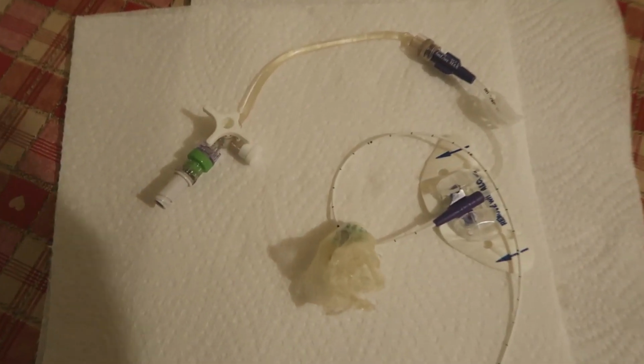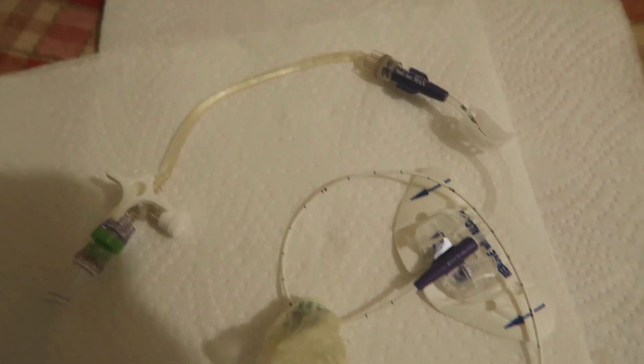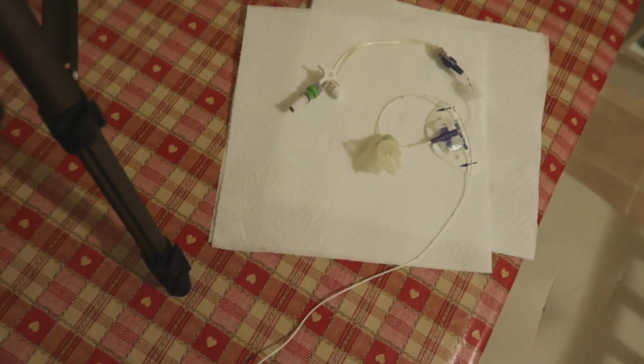So here's the crazy bit. This was all in me, round to the vein above my heart. Isn't that mad? Look at this bad boy. The wonders of medicine. I just find it fascinating, the amount of time and effort it took to put that in the right place, using ultrasound and all these different tools and needles to get that in my arm in the perfect place for it to last. And then it took me less than 5 minutes to take it out. Crazy. And that was the last clip I filmed.